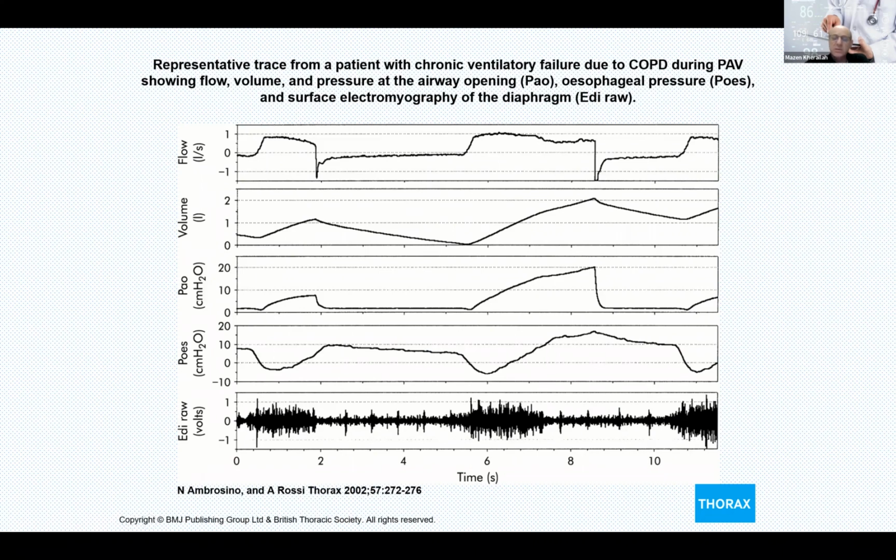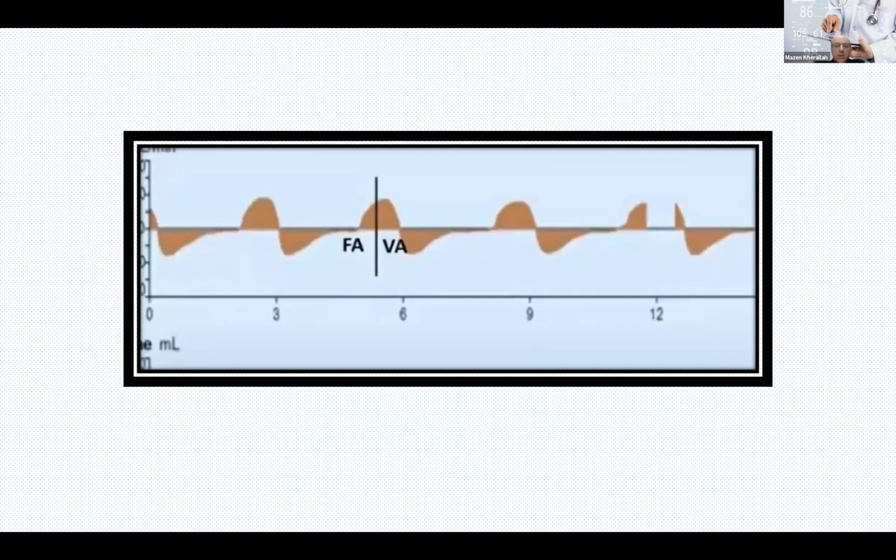And as I said, it's not clearly understood, but it's related to the technology inherent with this mode, and it is because of the delay in the response of the ventilator to the cessation of the electrical activity. So in summary, just you need to put in your mind that you have the breath or the inspiration. The initiation of it is airway resistance. You increase that by flow assist. And the second part of it is when the flow goes inside the lungs, and you increase that by volume assist.